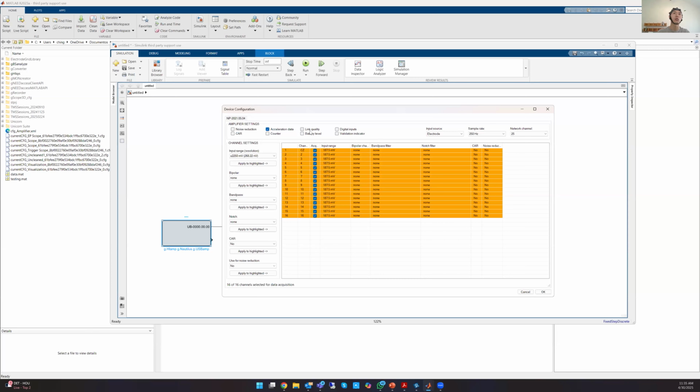You can also see a link quality, the data communication quality, and the battery level of the Nautilus. For 16 channels, you can run it for, let's say, 8 hours after a full charge. So it's pretty good. Sampling rates are 250 or 500. Let's just use 250 today.